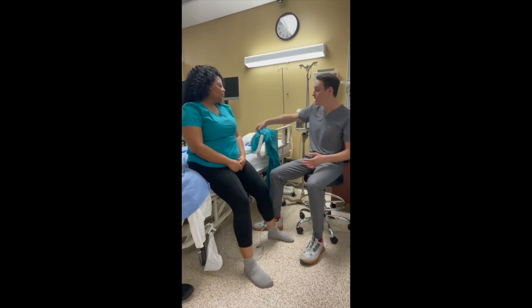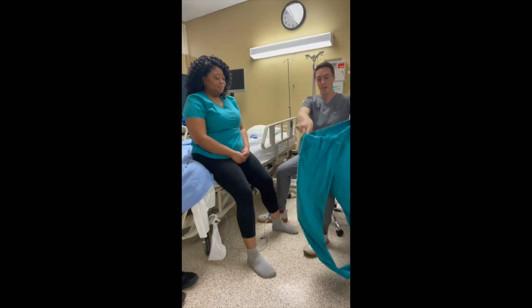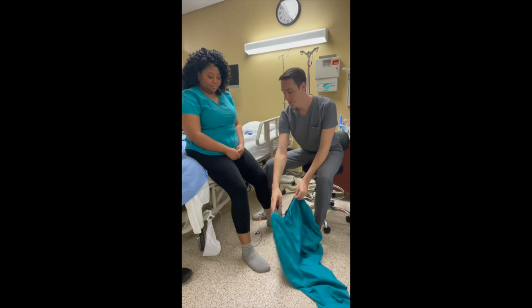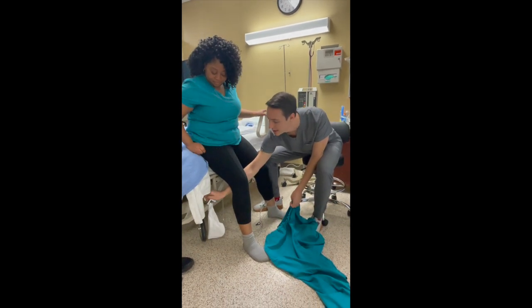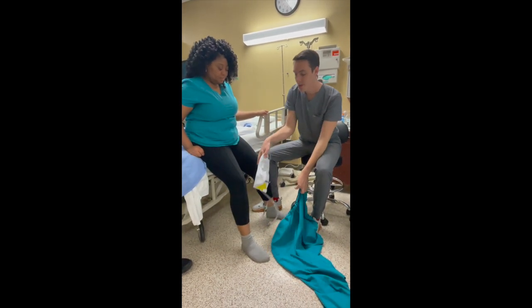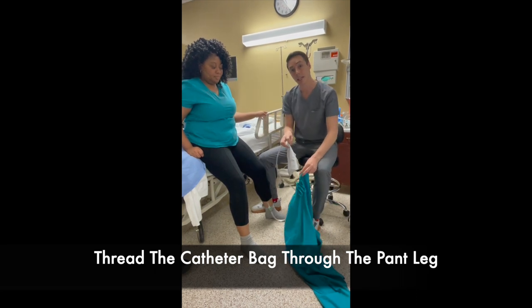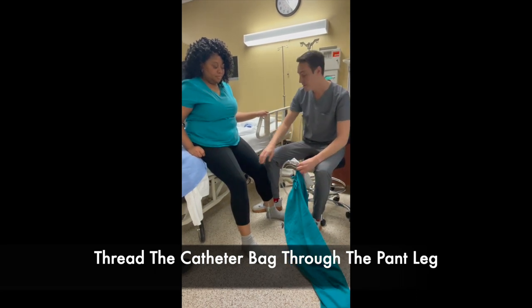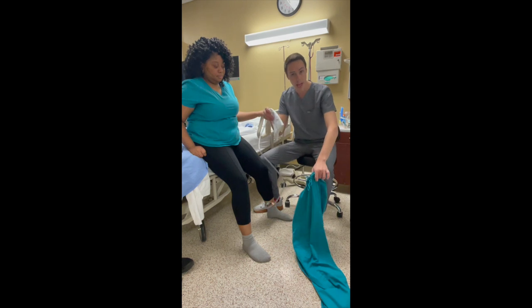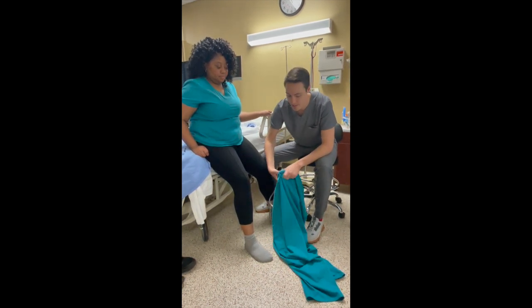What you want to do is get the patient's pants and have them down. You'll take the catheter bag and you want to don the catheter bag through the pant leg that it's coming out of. Hers is on her left leg, so we'll don the catheter bag through the left pant leg.